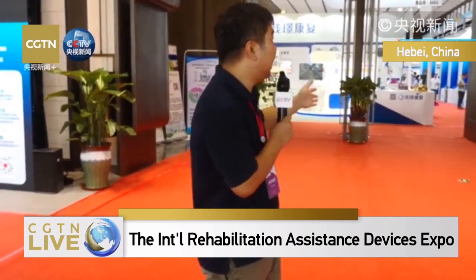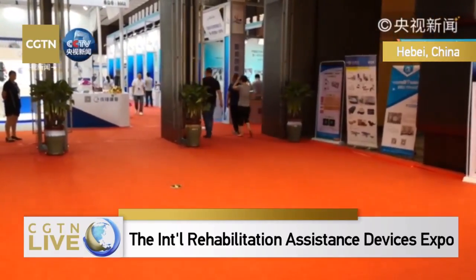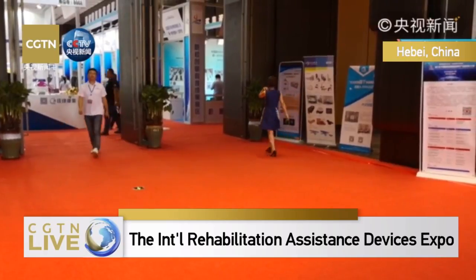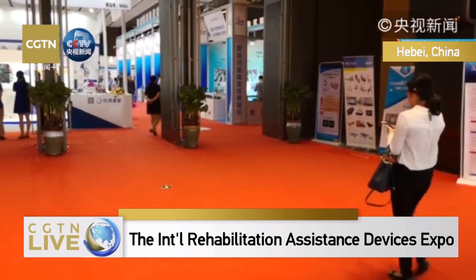In this exhibition, we have seen a lot of devices, some robotic exoskeletons, and we see how they help the patients to stand, to walk, to train, or restore their motor functions. And we also see a special exhibition hall for universities and research institutes to showcase their research results and lab products so as to expedite the marketization process.